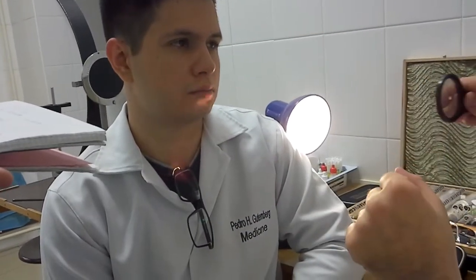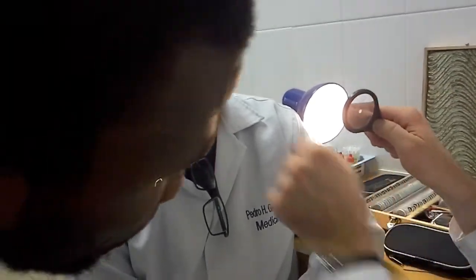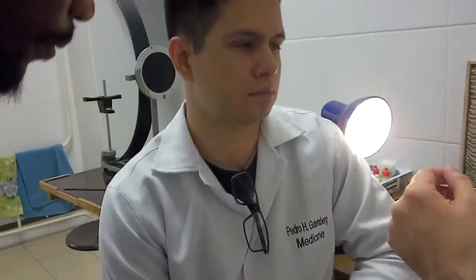The distance from your eyes to the patient should be about 20 centimeters — rather close — because it is necessary to see clearly; small, mild opacities you cannot see at a large distance. Now, I look through the aperture in the center, and I put the light in his right pupil. Now I see the red reflex from the fundus of the right eye. Normal red reflex — everything is okay.